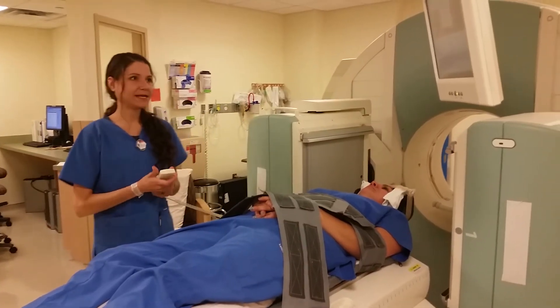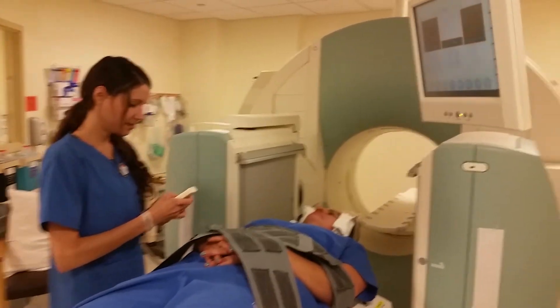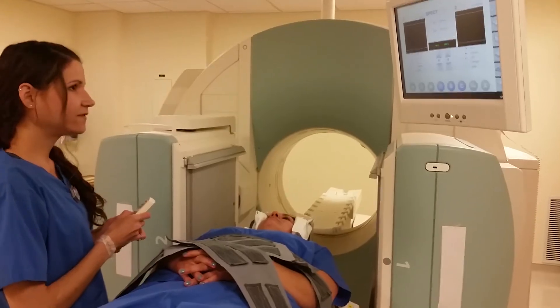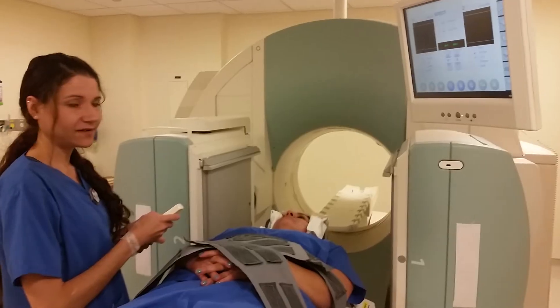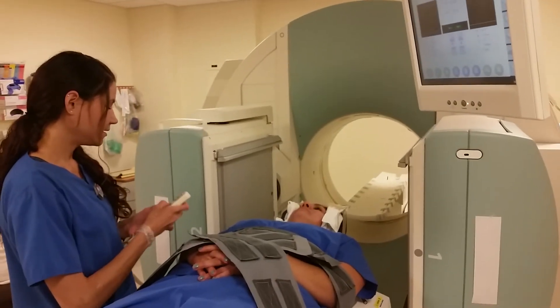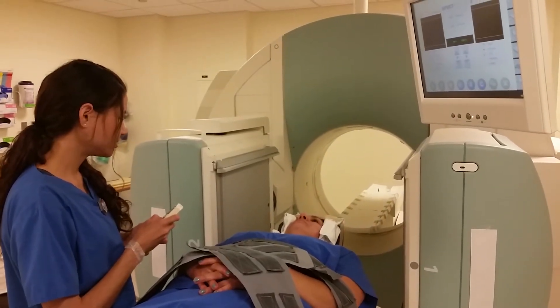Just to make sure I have the patient in a good position, I want to move the detectors in. The goal is to move the detectors in 13 to 15 centimeters, just to make sure it's good.